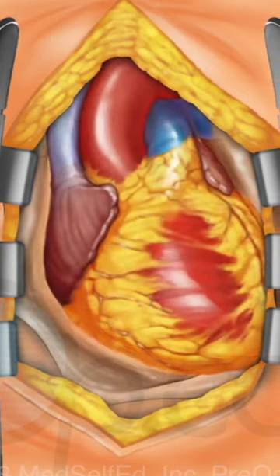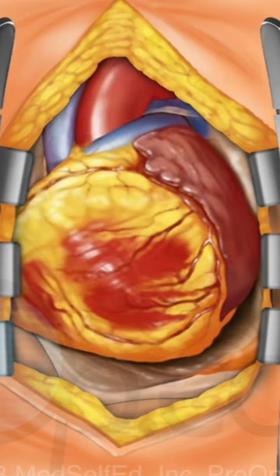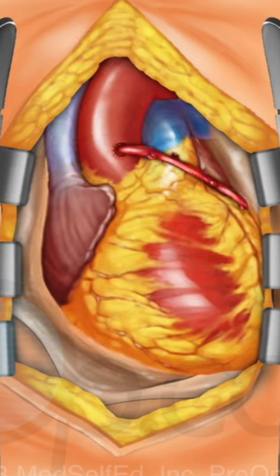The surgeon inspects the heart and identifies the vessels to be bypassed. The intended grafts are stitched into place as needed to complete the necessary bypasses.